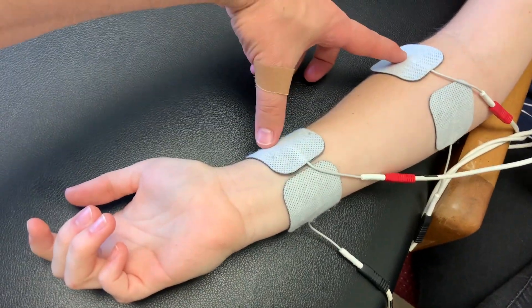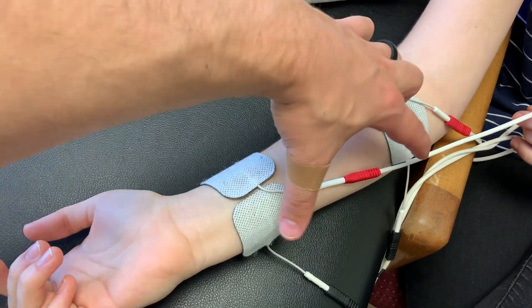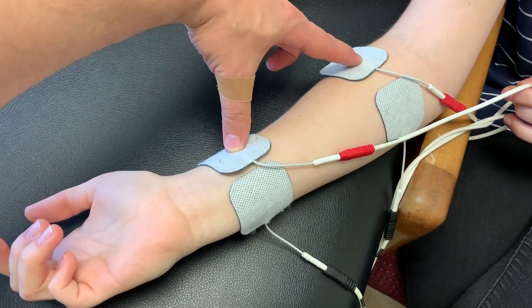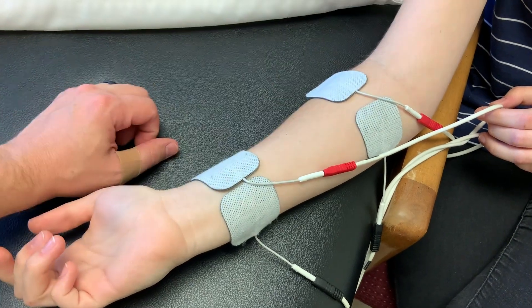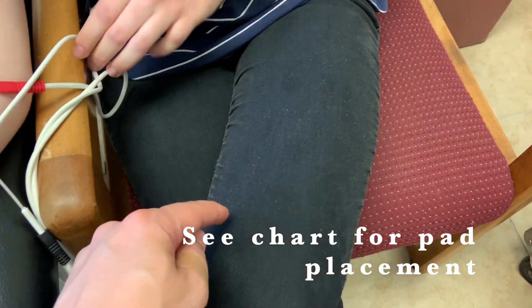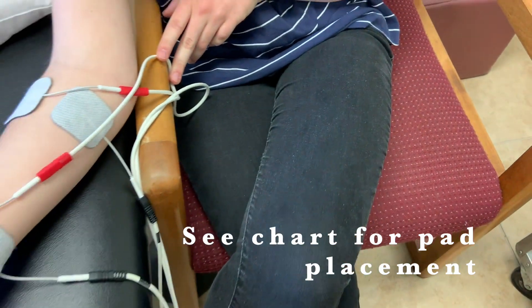On Megan here, we have a red and red stimulating this muscle, and then a black and black stimulating this muscle. You turn up the first one and start it, then turn up the second one and start it — and then they will go at the same time after you start the second one. This is common if you're doing it on a leg; you may do the inside of the leg and then the outside of the leg, if that is the case.